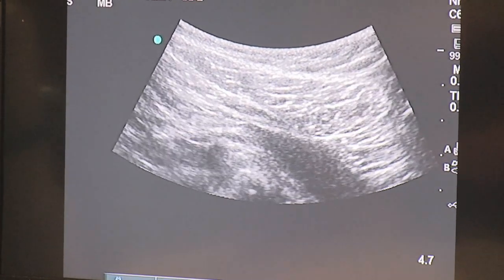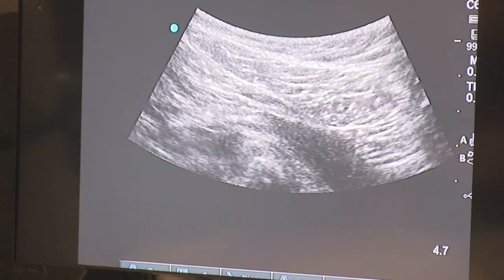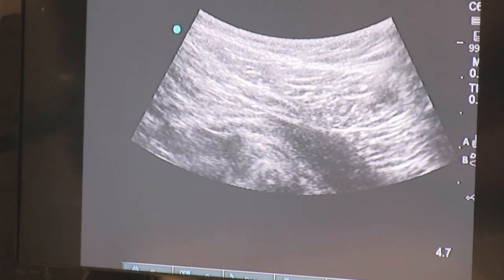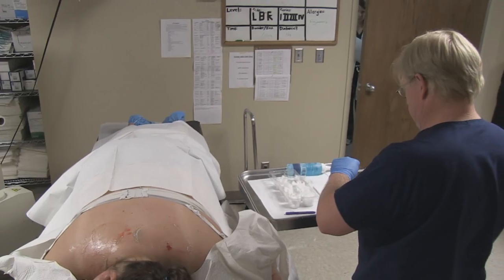Sometimes it takes a few times. You can see the needle there. There's a little bit of slowing down. You can see the medication going in. We'll see what that one does.